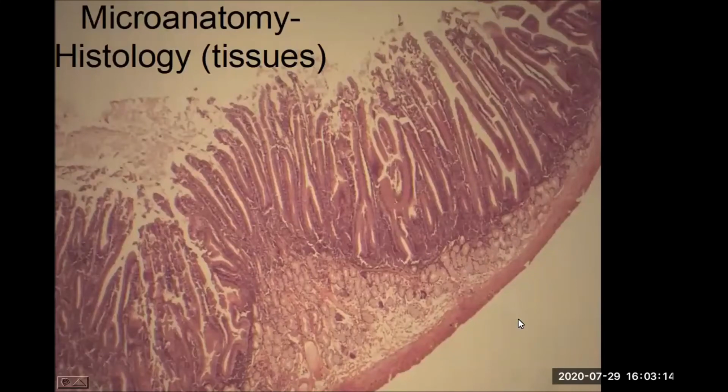So we're moving again now into histology for epithelial tissue. And at this point, we've seen this image before, the histology of the duodenum, the small intestine segment. And this time we're going to focus specifically on epithelial tissue. And in the case of this sample, we're actually seeing a large amount of epithelium right here at the pointer.